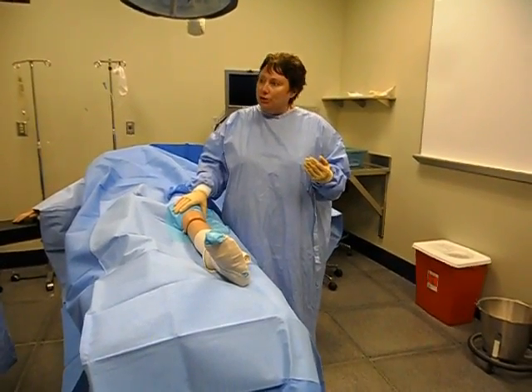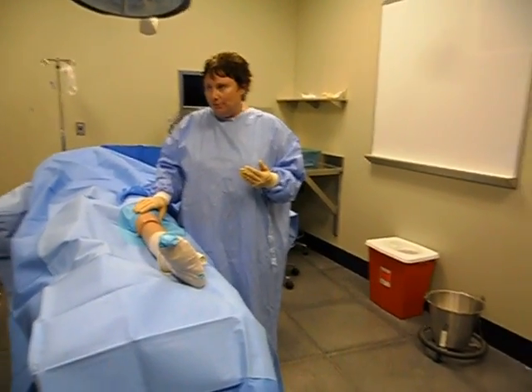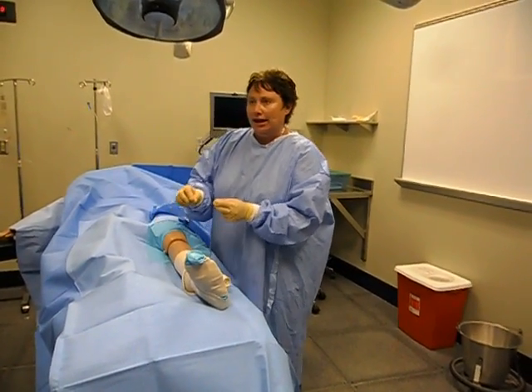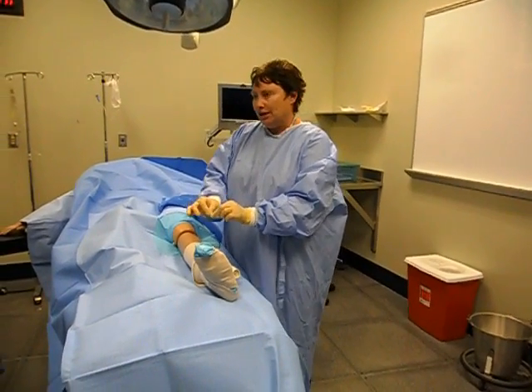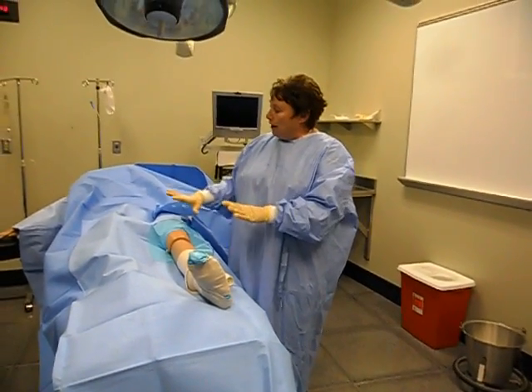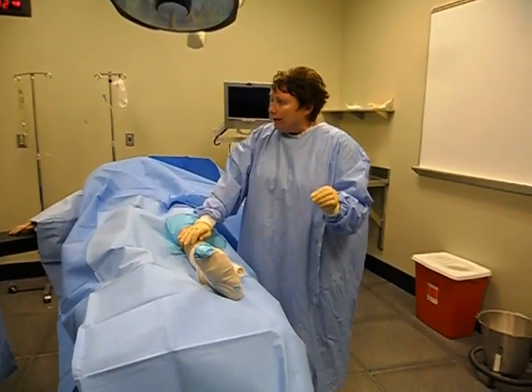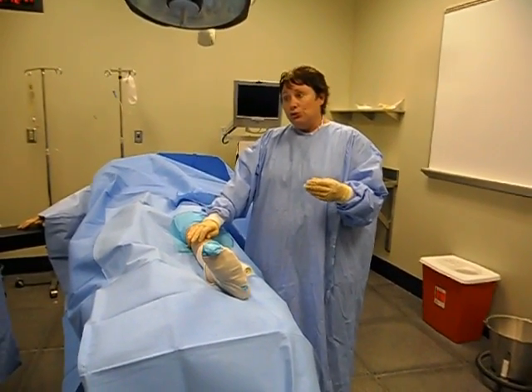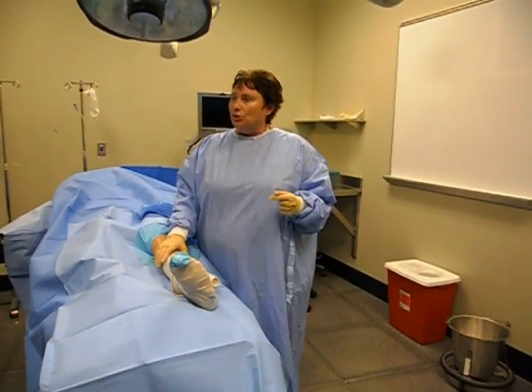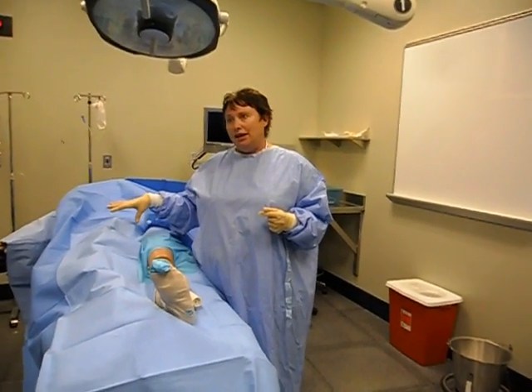This drape is called an extremity drape. There is also a drape that looks almost identical to this called an arthroscopy drape. What that has is the same blue rubber but with a plastic bag — it has a little tip and you hook up suction tubing to it. It's like a triangle bag because we use a lot of fluid to flush the knee with. The drape process isn't any different; the drape itself just has that clear bag you attach suction tubing to, which connects to a suction canister or a kick bucket so the fluid hopefully won't go in your shoes.